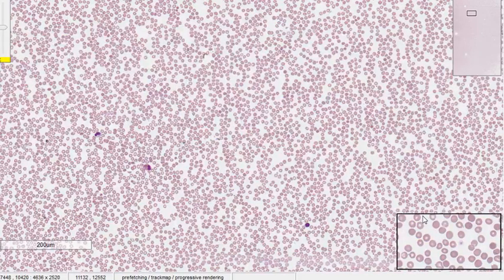This is a case of a 5-year-old child who has been having a fever with chills and rigor since last week. In fact, her fever has been waxing and waning for the entire week. She is also refusing to eat and had episodes of vomiting. They also give a history of travel outside their native place. So let's go into this slide.